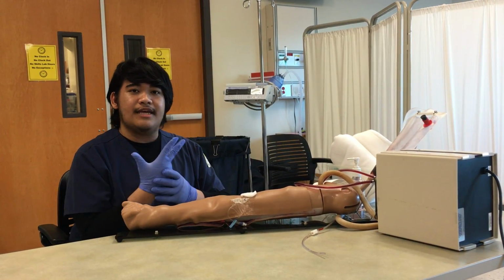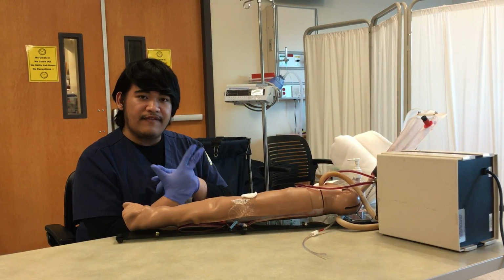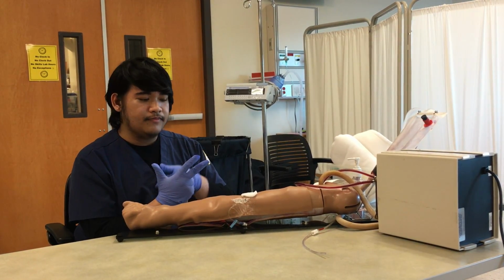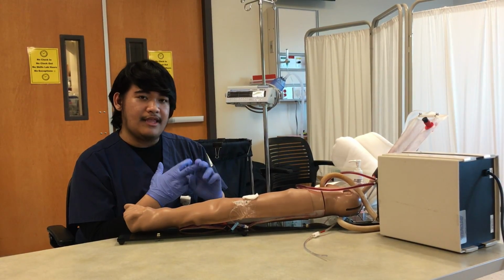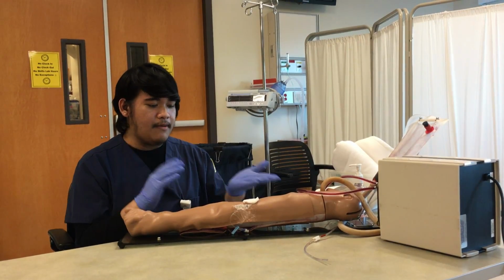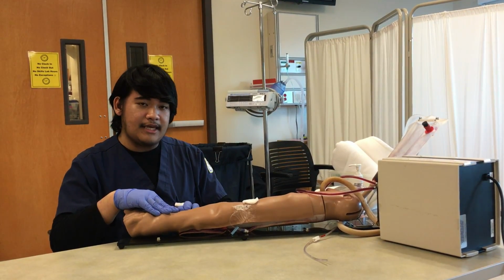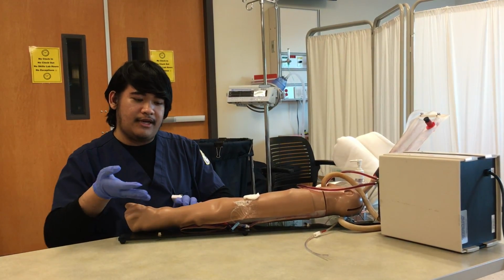We have 3 sites we could use: the radial, which has a 45-degree angle, the brachial, which has a 60-degree angle, and the femoral, which has a 90-degree angle. At this point, I would do it on the easiest one with the fewest complications, which is the radial.